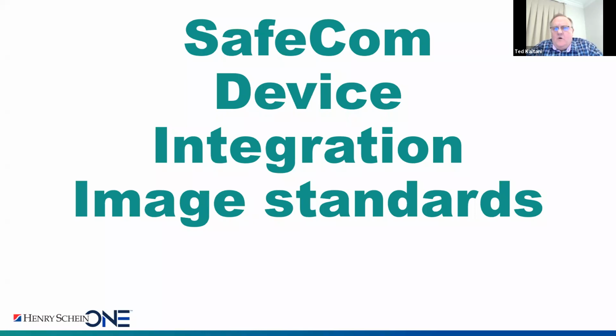One other thing that is so important when using standards is the liability that is posed to the customer, to the user. One, to the vendor of the software, two, to the user. Why? Because we have Health Canada or FDA approvals for medical devices. So if you are a manufacturer of a hardware, you have to get that medical approval from Health Canada or FDA, or otherwise, if you're selling, it's illegal.